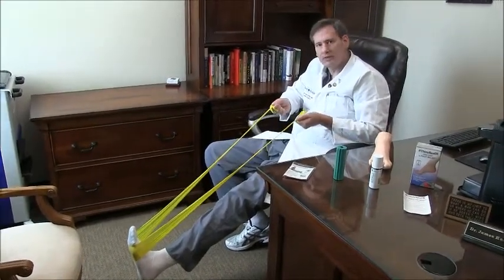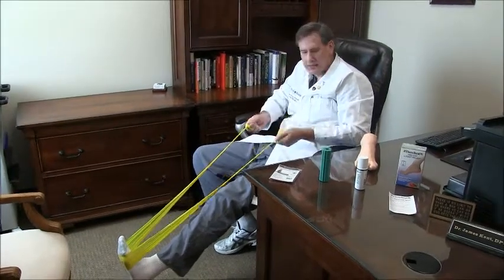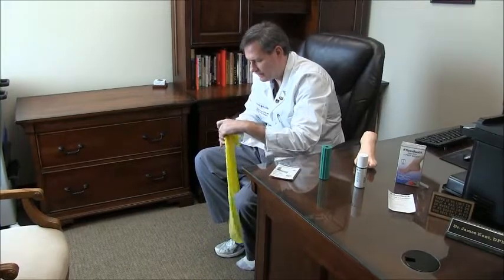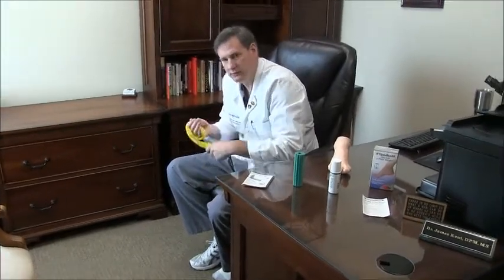It also helps with Haglund's deformities and Achilles tendonitis. That is a plantar fascia stretching kit. We have these at the office and we recommend them for plantar fasciitis pain — they really work well for patients with plantar fasciitis. See you guys, bye-bye.